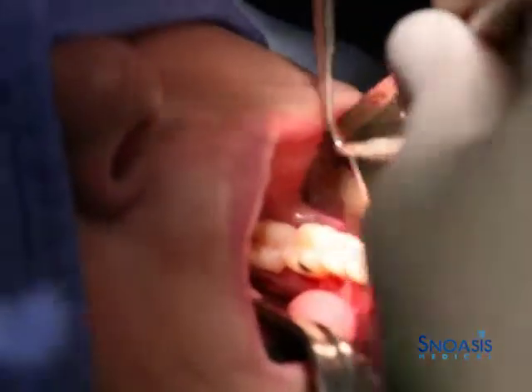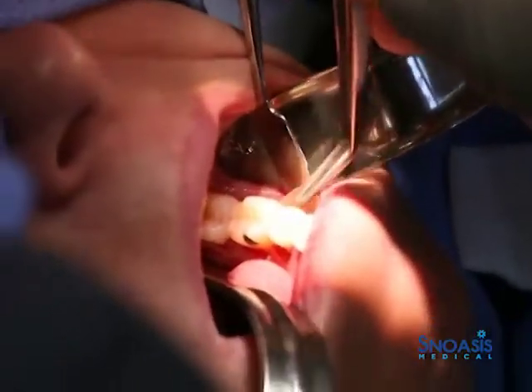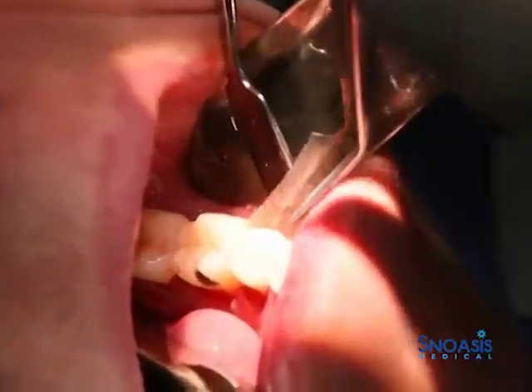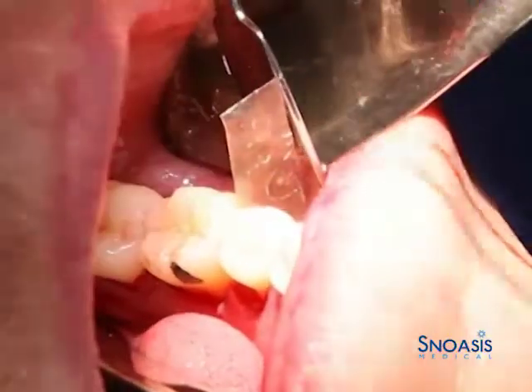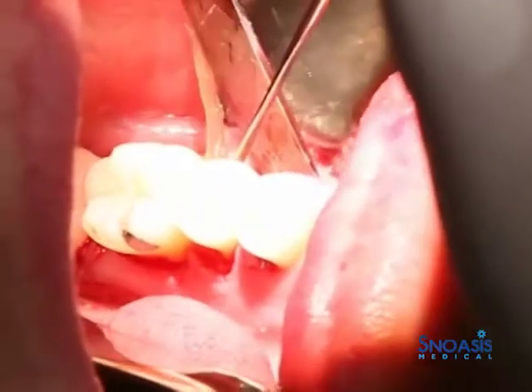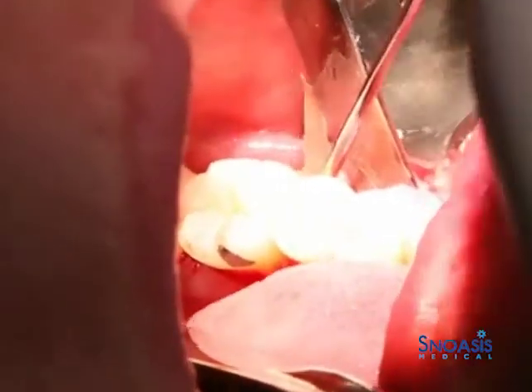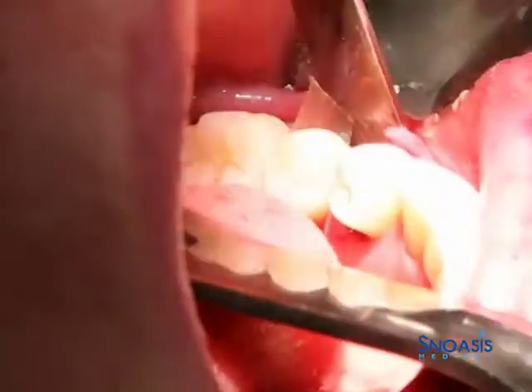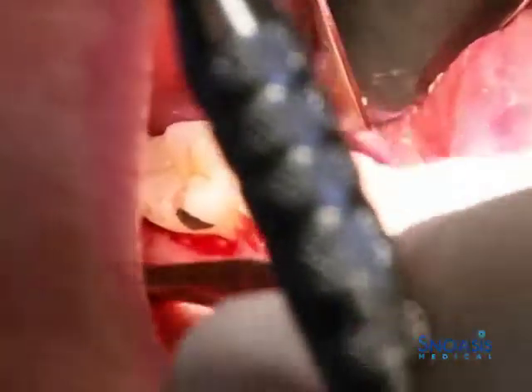This is usually the most tricky part. We're just going in with this nice and dry, and usually we're just going to try to get it in there a little bit. I like to take a tunneling instrument and just push it through.